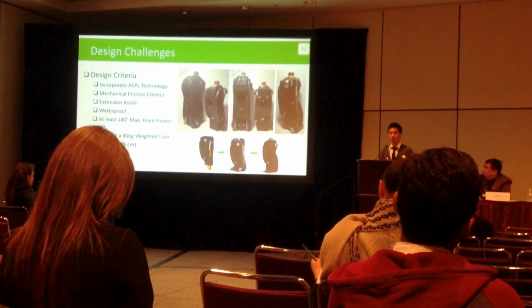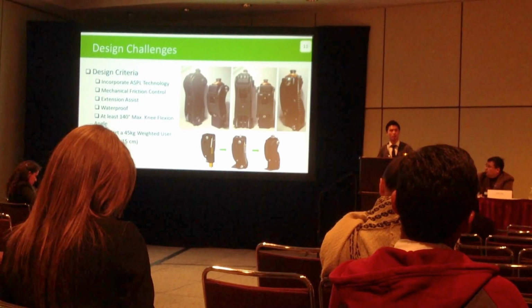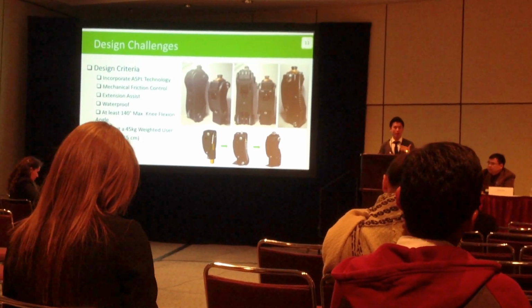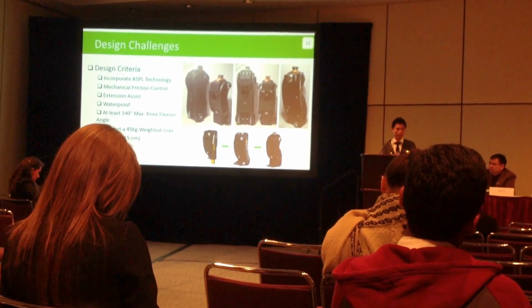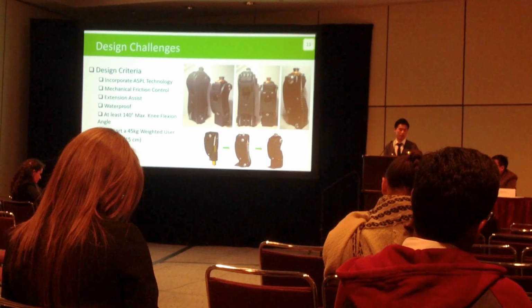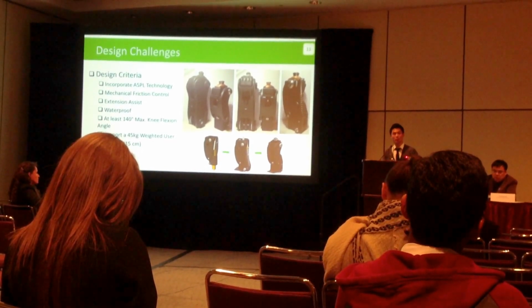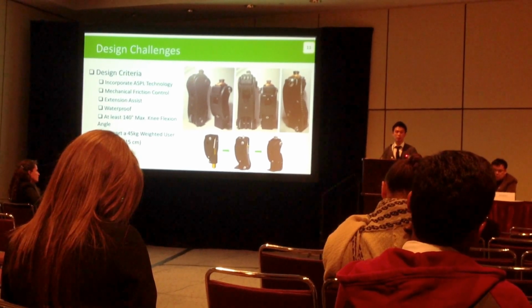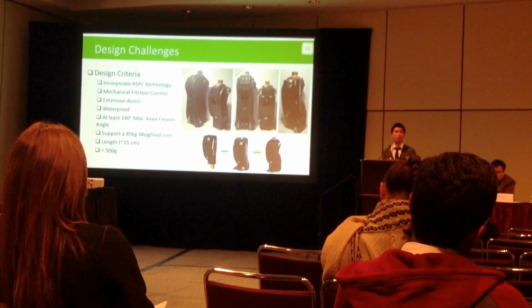And the reason why we think that is okay is that the adult knee has been tested for a long time in the field, and it seems that all the users have been okay walking with it. So we think it might be okay to just pick that number and stick with 60%. But at the same time, to accommodate younger kids, we also have a 40% spring designed into it. So based on how the kids perform, we can also change it as well.